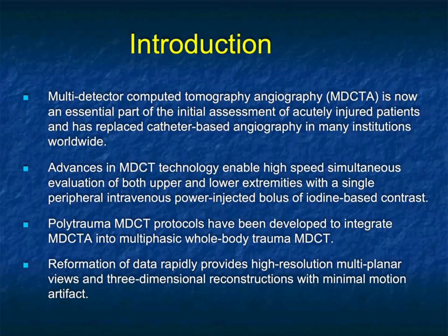Not every patient with mild trauma should be getting a scan, obviously. And patients with major trauma do need a CT. The thing is, we're trying to optimize throughput, get the patient done, get the images analyzed, and get the patient managed quickly. I think in the future, AI is going to have a major impact in both determining what patients get scanned, how they get scanned, interpreting the scans, and creating the 3D images.